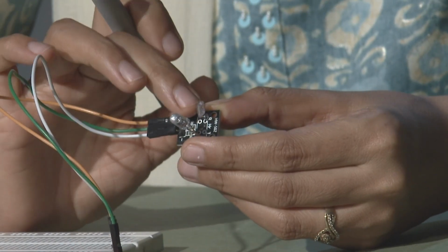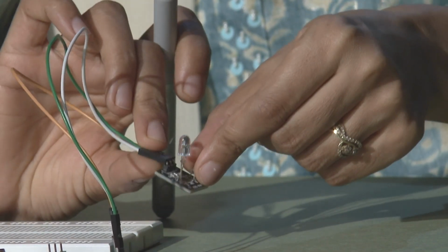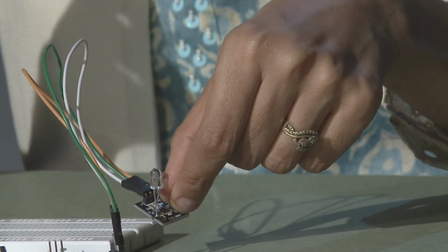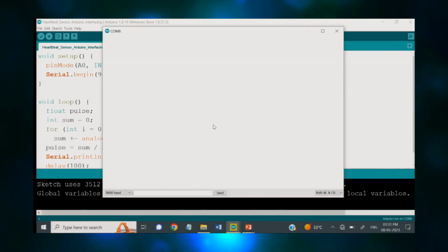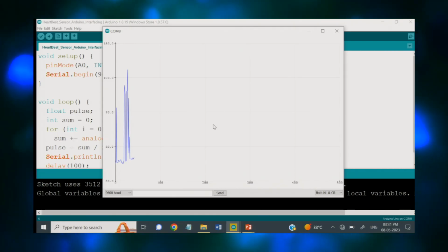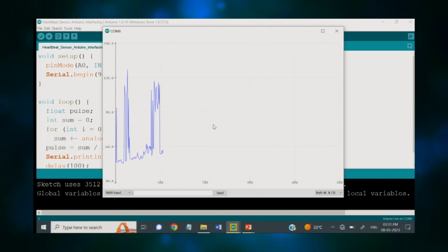So, here you can see on the sensor terminal, this particular one is your pulse sensor terminal. I will be using my finger right here, holding it gently without pressing too much or putting it too lightly on the sensor. And then I am opening the serial plotter here, and you can see slowly your pulse readings are building up. Depending upon how I have held the sensor, it will keep on plotting things.